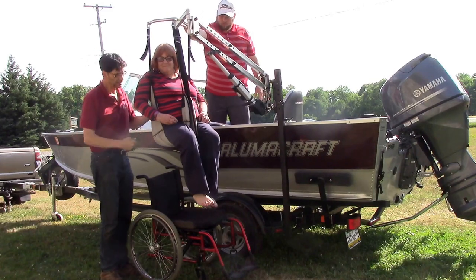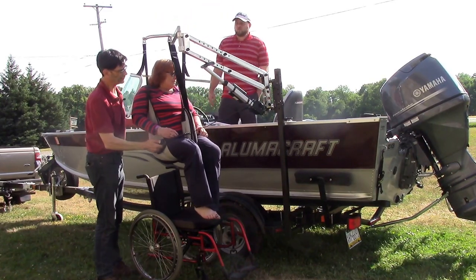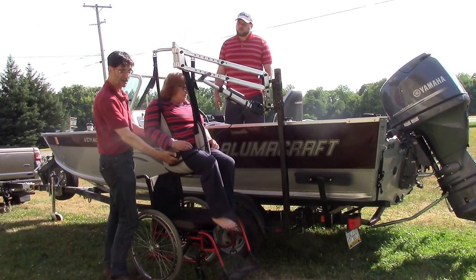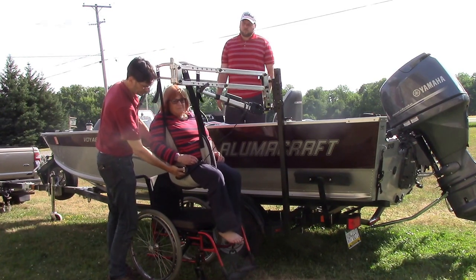Now remember, this can be done adjacent to a dock. People even have multi-lift — the mounting post here that you see can actually be mounted on a boat dock. So that's going to give you some different options here.